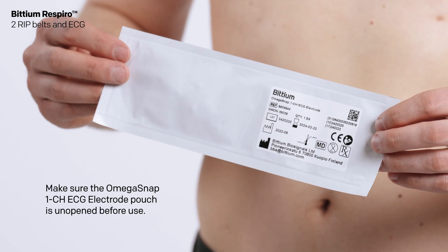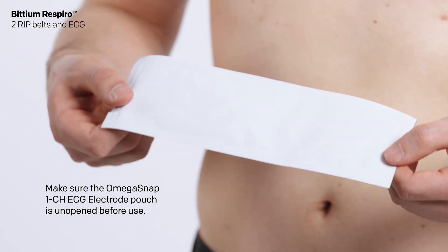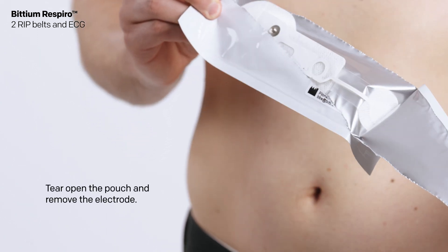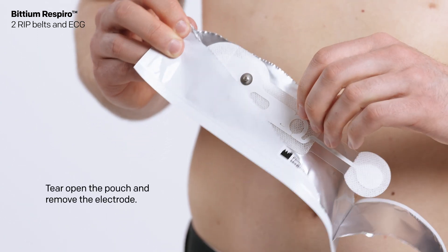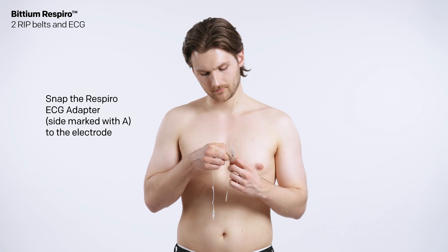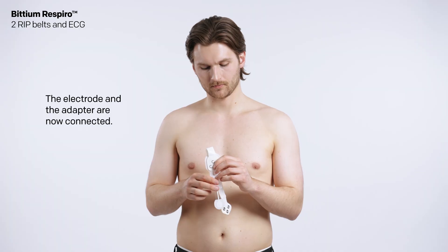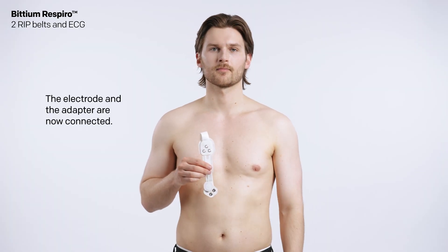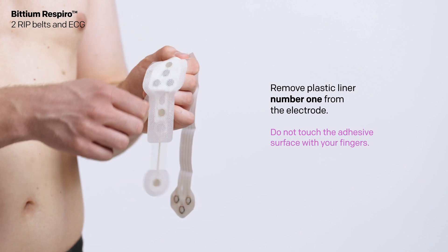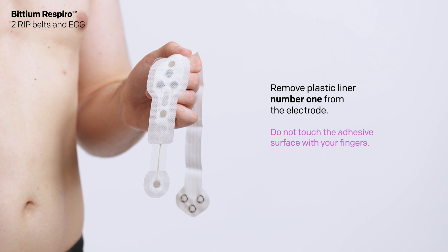Make sure the Omega Snap 1CH ECG electrode pouch is unopened before use. Tear open the pouch and remove the electrode. Snap the Respiro ECG adapter to the electrode — the electrode and the adapter are now connected. Remove plastic liner number 1 from the electrode. Do not touch the adhesive surface with your fingers.